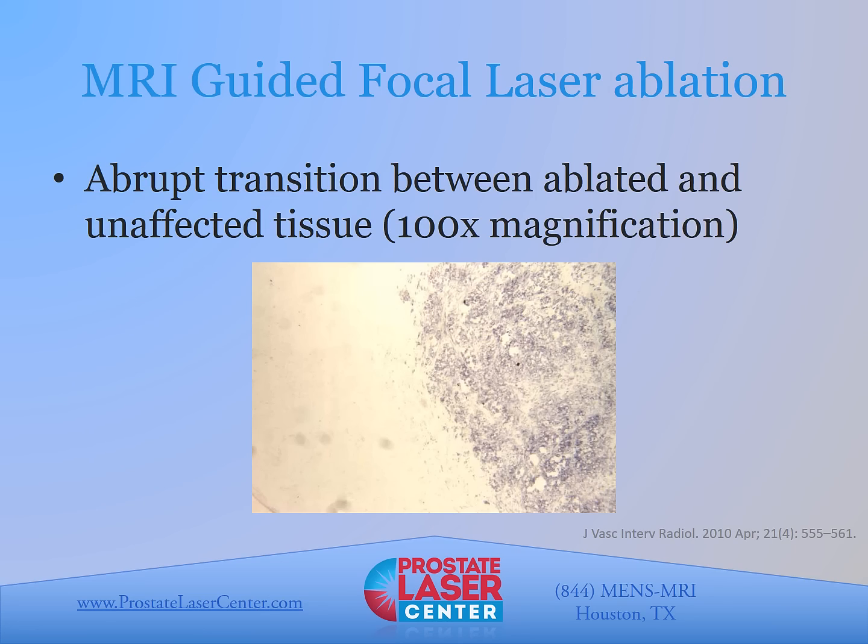Here we have a pathology slide at 100 times magnification, and we can see that there's a very tight transition between the area of complete ablation and area of unaffected cells.